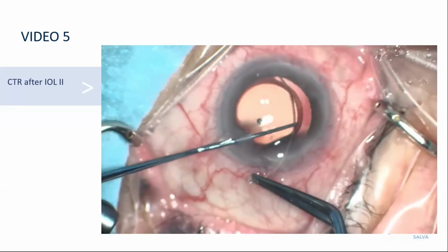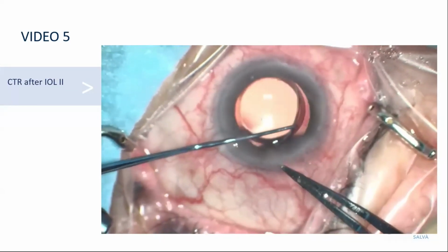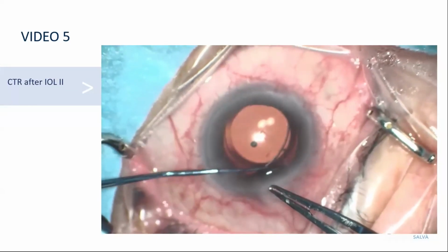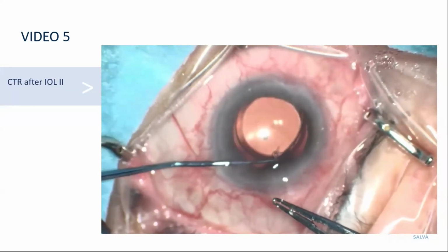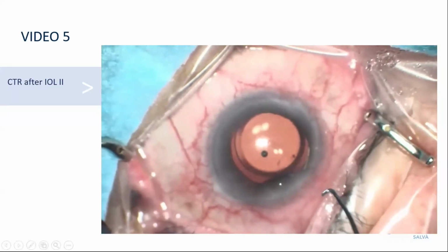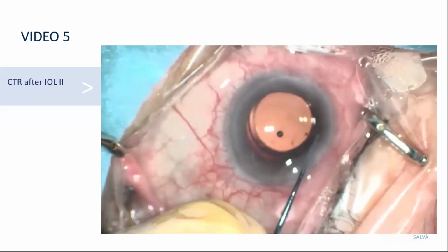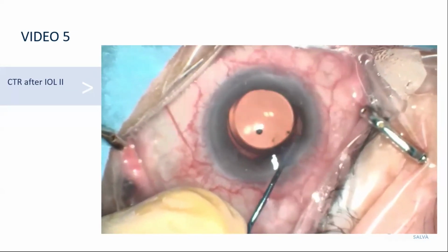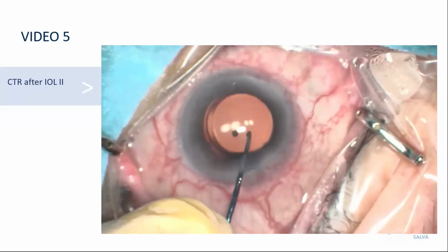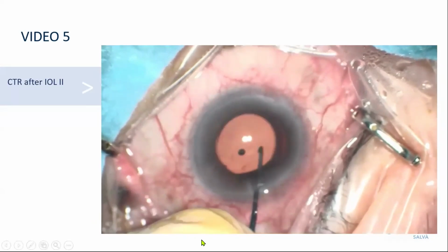And in a premium surgery, you don't want any intraoperative complications. You don't want a complication at any level, but you don't want an intraoperative complication. So you never run with a premium lens. You do a quiet surgery, tranquilo, no problems. You follow the rules, you do the ABC all the time, and you will find no problems, and you'll be so satisfied with the results. You'll never go back again to do surgery without implanting the CTRs.